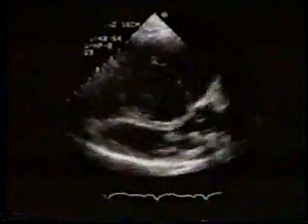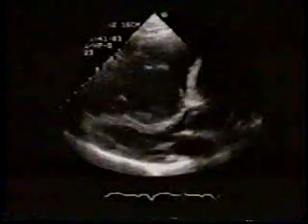Here is the elongated anterior leaflet of tricuspid valve and inferiorly displaced septal tricuspid leaflet in this position. Observe these abnormalities in real time now. You can also appreciate abnormal septal motion and wide excursion of the elongated anterior tricuspid leaflet.